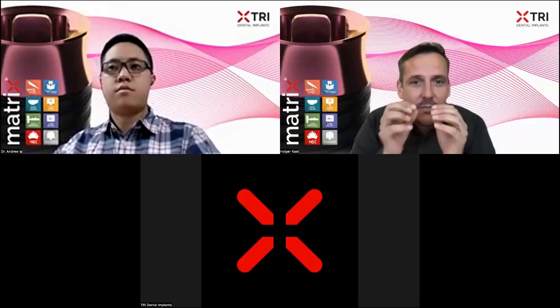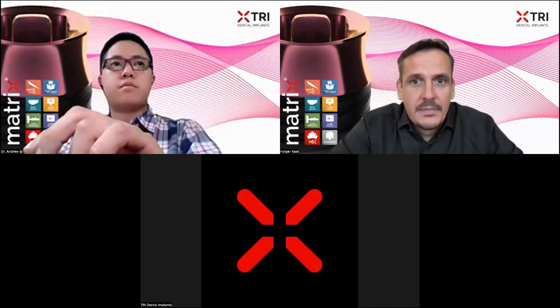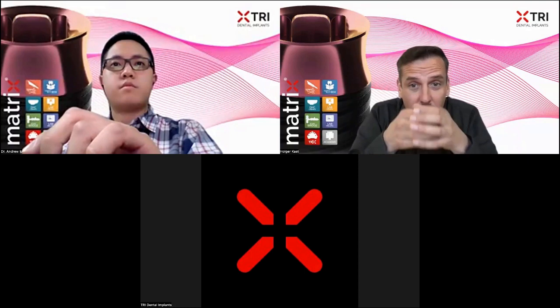I just answered a question in this time from Nilovar. Thank you for the question. Can we print only one model at a time? This depends on the size of your printer plate. So there's printers, and I think also when the technique allows us, Andrew is going to show us a technique where you can print very small crowns in a very small bath.